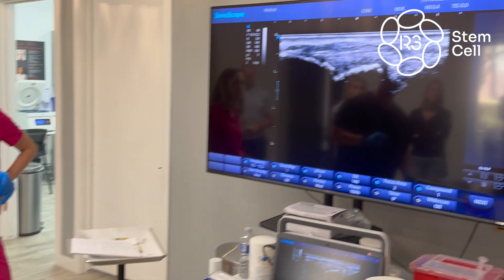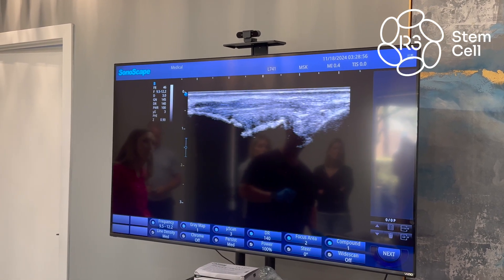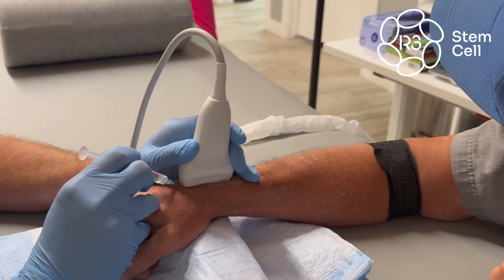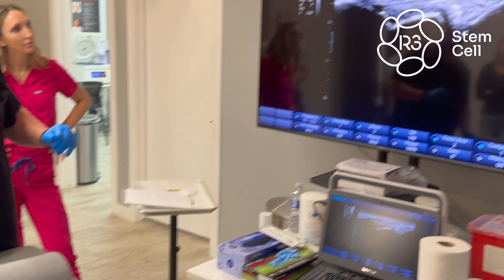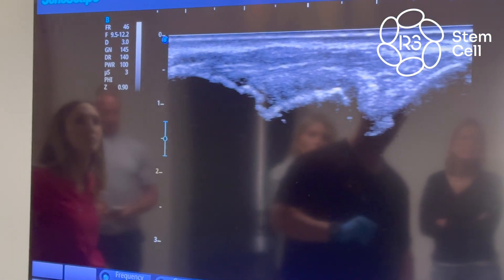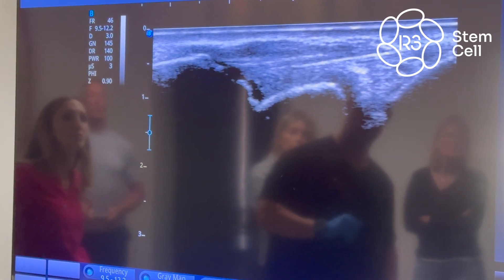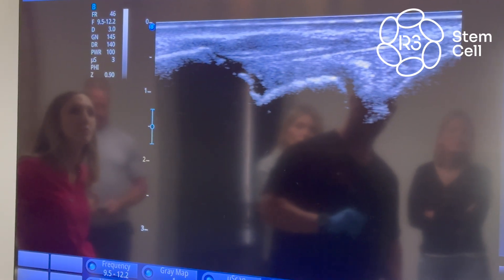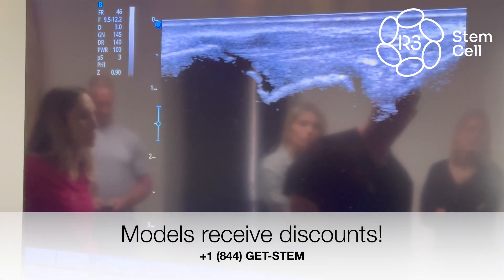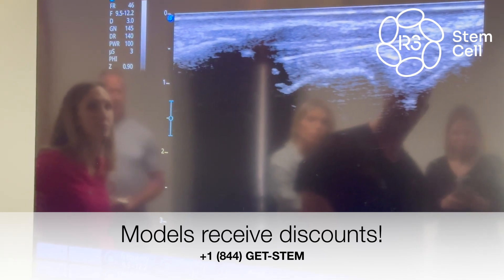That's a great trajectory. Go nice and slow to find yourself. Good adjustment — keep coming, keep coming on that straight line. Advance, advance — just a little further, a little further. You're there — put a half CC right there.